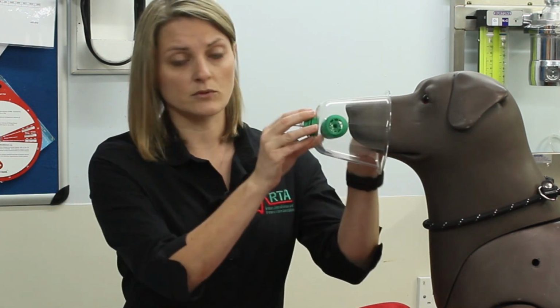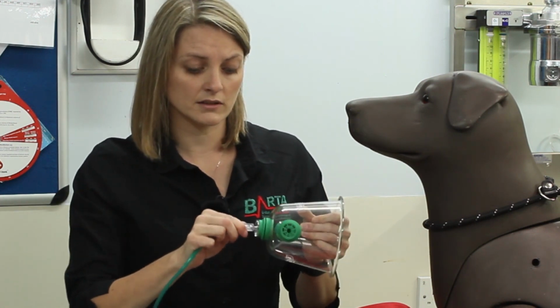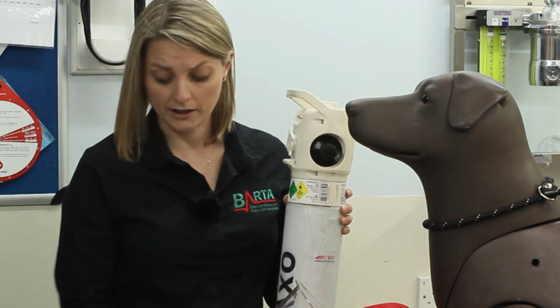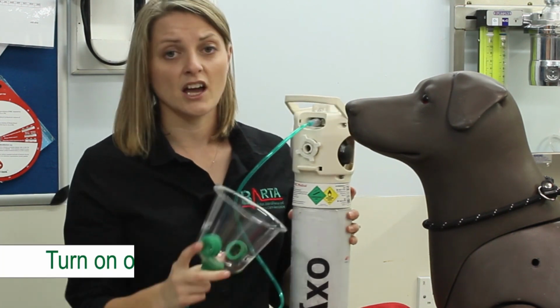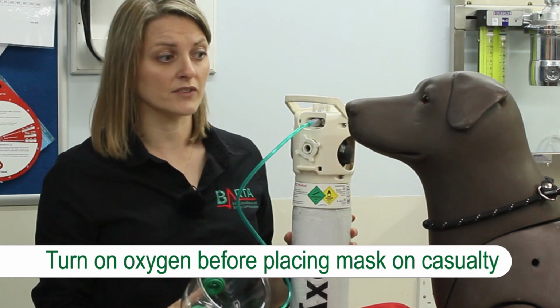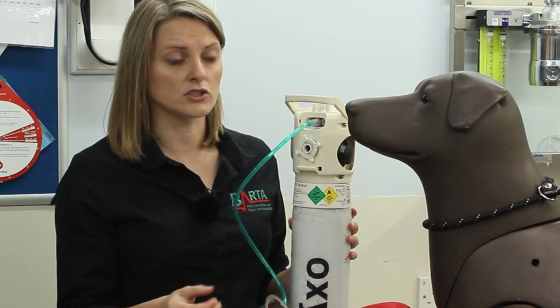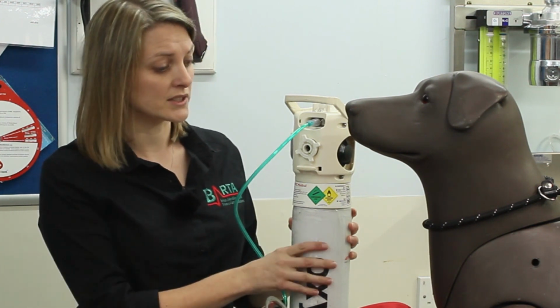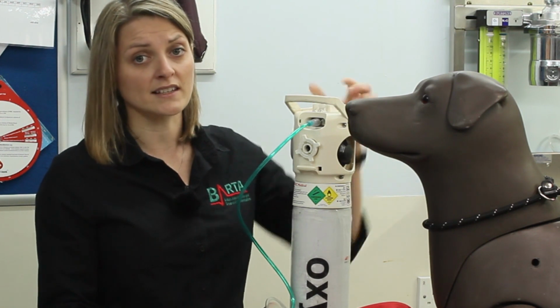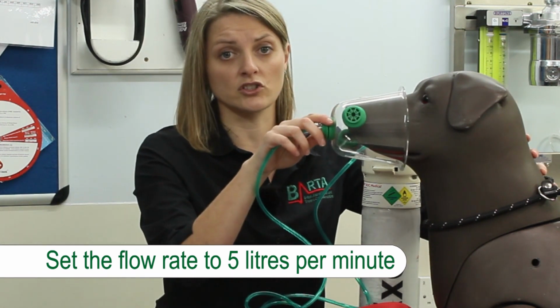So once we've decided which mask fits our animal best, we're then going to set it up. It comes with the nice oxygen pipes, so simple attachment on that end, and these fit any kind of standard oxygen tank that you might be carrying, and they fit the standard outlet there for you. So pop that on. We then recommend turning on the oxygen first before applying the mask to the animal's face. Animals have a much superior sense of smell to us, and they actually find the smell of the oxygen plus the pass of the flow-by the face quite annoying. So sometimes it's better to turn the oxygen on first. We recommend just setting it at 5 litres per minute flow. And once that's set, then it's just a case of applying the oxygen to the animal.